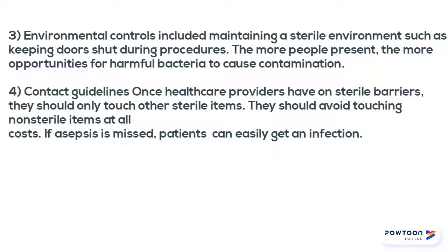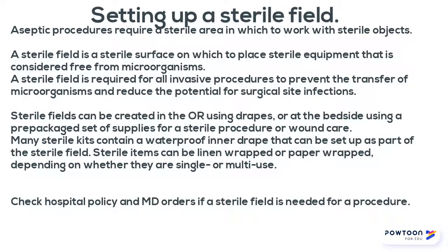Contact guidelines ensure that when we are sterile, we only touch sterile items. We do not touch any non-sterile items. We will now set up a sterile field using aseptic technique. We will go over the items listed on this slide to identify how the sterile field is maintained during the establishment of our sterile field.